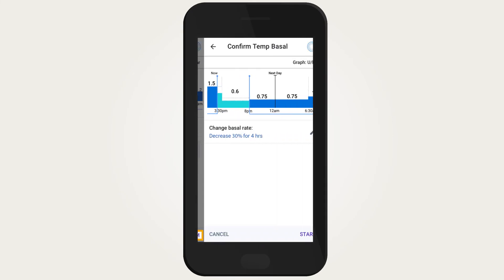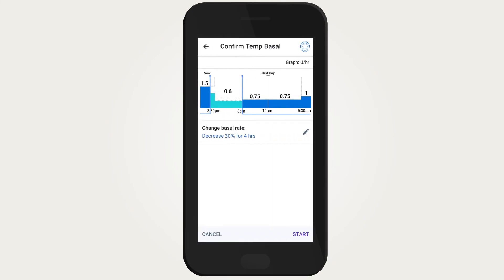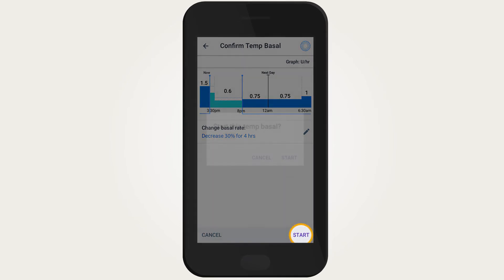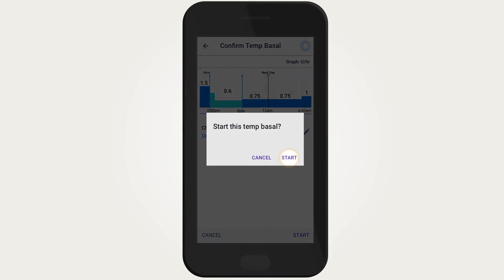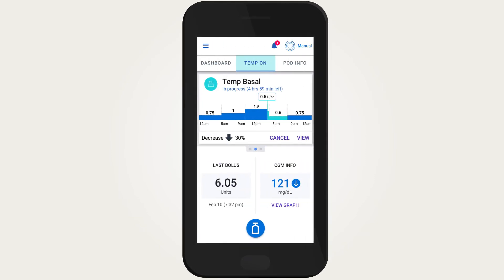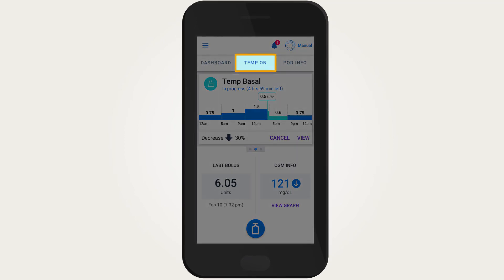Once you have entered the rate and the duration, tap Confirm. Review the temp basal details — if corrections are needed, tap on the row you would like to change, enter your corrections, and confirm them. Tap Start, then tap Start again to begin the temp basal. The home screen will indicate that a temp basal is active by displaying 'Temp On' in blue.